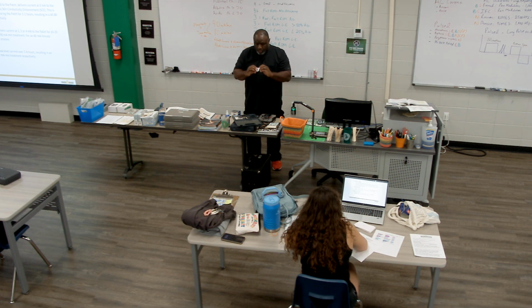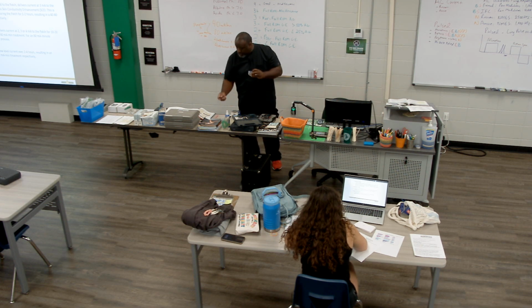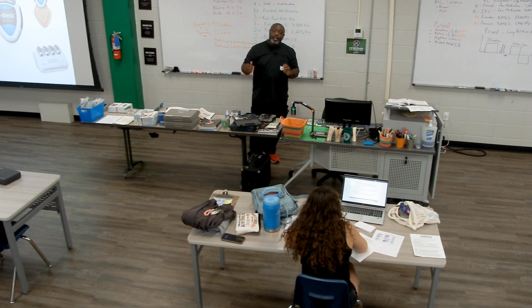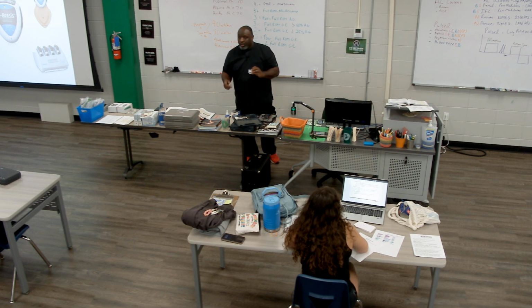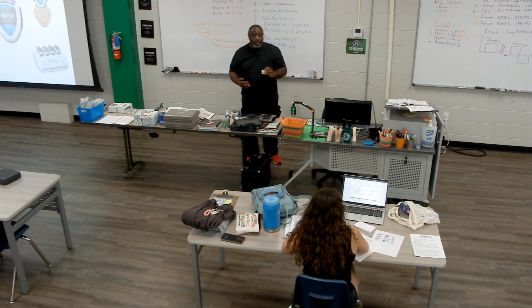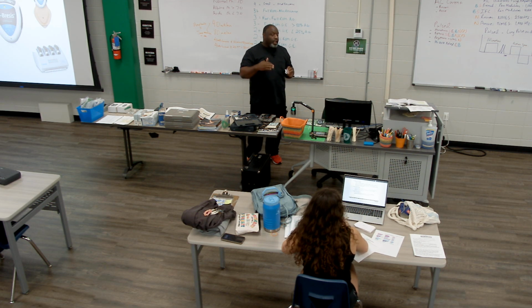What you want to do is click on the top. There's a button on the top called standard mode. So let me go back here. So there's a button right here on the top of it called standard mode. You click on standard mode, and that allows you to use this like a normal ionto unit, where you can select 2, 3, or 4 milliamps of current and treat for a normal treatment.